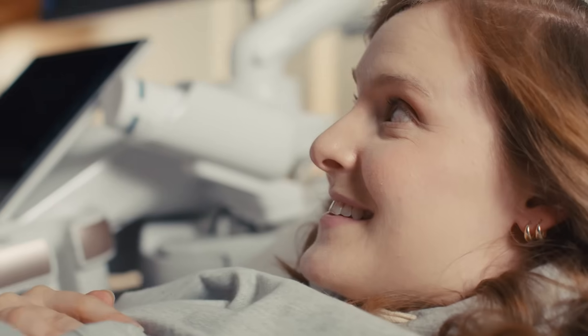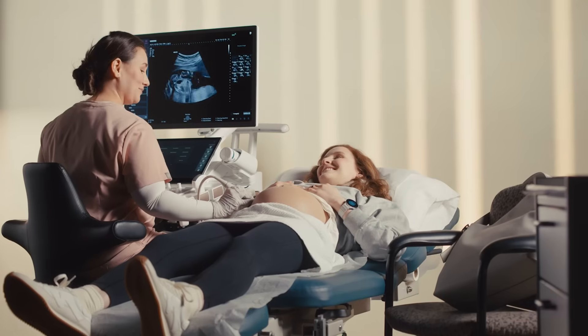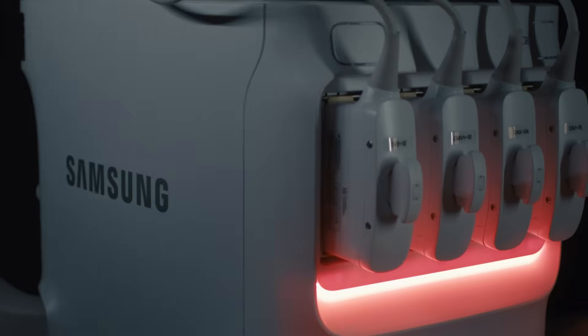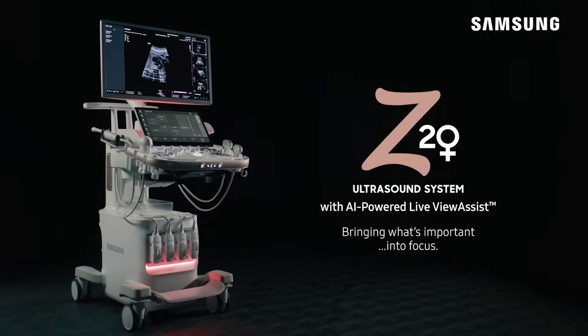But most of all, Samsung Z20 lets clinicians focus less on knobs and toggles and more on what's really important — their patients. Samsung Z20 with AI-powered Live View Assist and Easy Check. Bringing what's important into focus.